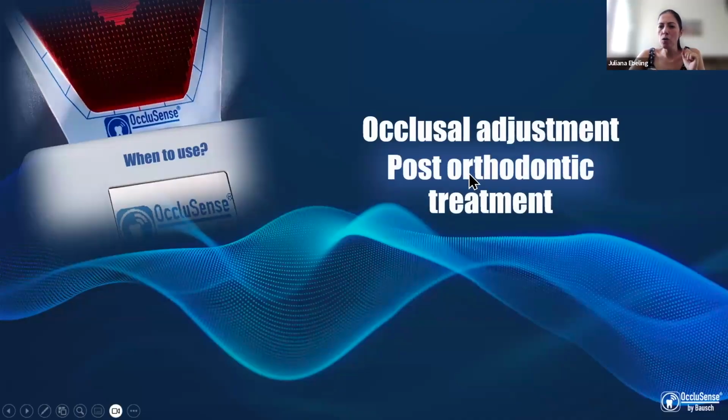After occlusal adjustments, after orthodontic treatment, for us here in Brazil, it's very, very common and very needed. Why? Mainly I attend adult patients, and normally I receive patients with tooth surface anatomy damage.